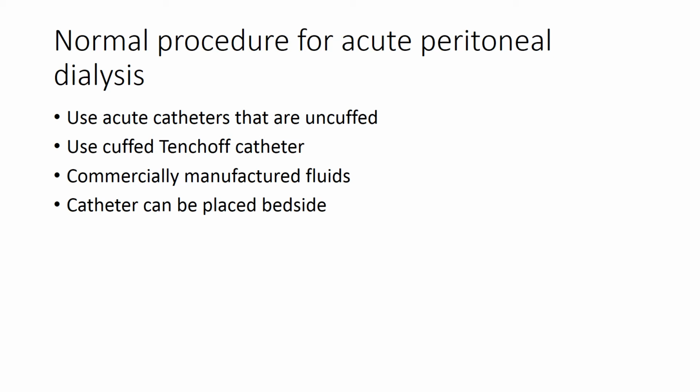About 80% of our cases of acute kidney injury in the unit are secondary to malaria, and generally speaking, these patients require dialysis for between 14 to 21 days. So obviously for us, we tend to use more of the double cuffed Tenckhoff catheters.